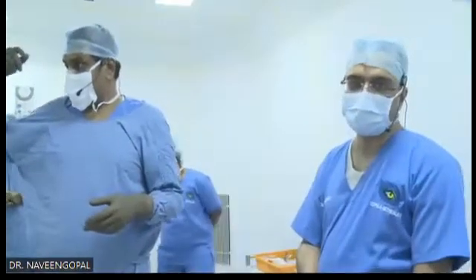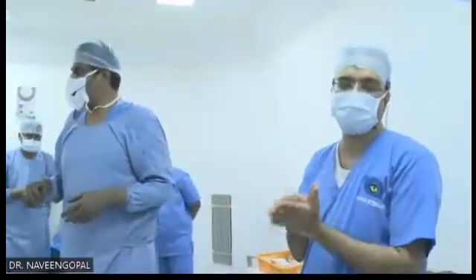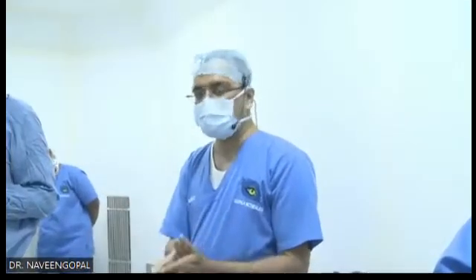The only thing we should keep in mind is that with star ICL, they say 2.7 or 2.8 is the minimum AC depth required. Here the lenses are a little thicker, so I prefer to operate when the AC depth is more than 2.9 or 3. Then I can easily put any Indian phakic IOL.